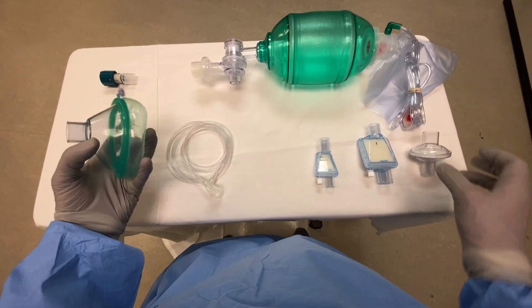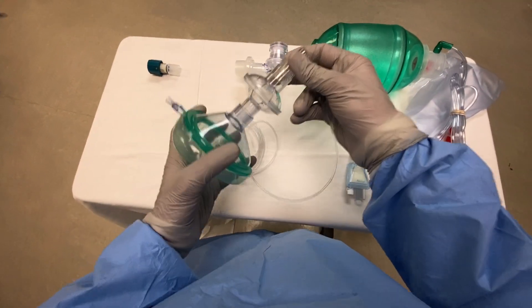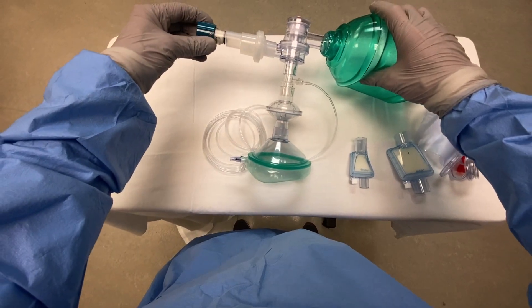We'll take our mask and connect the viral filter directly to it. Next we will connect our end tidal CO2 sampler, and we'll connect the bag to that. Now we'll take our peep valve and connect this to the exhalation outlet.